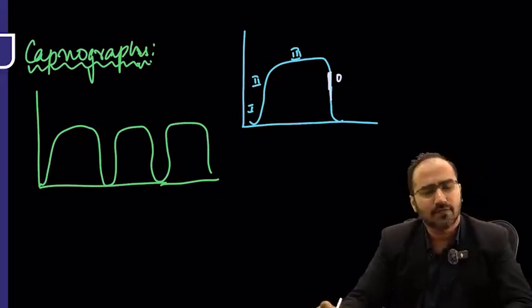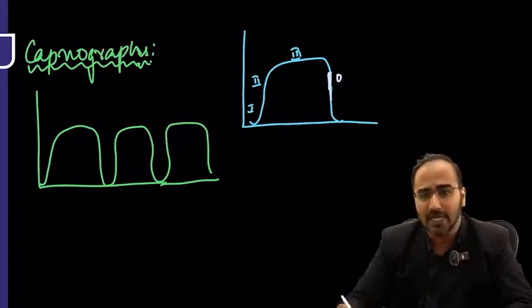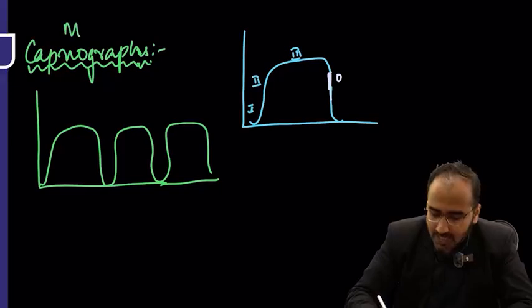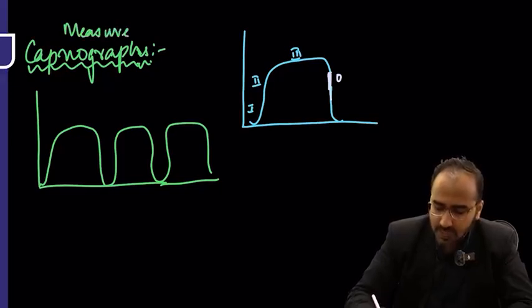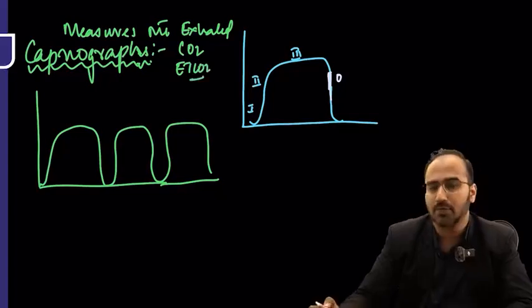Capnograph is the best test for confirming intubation. Now, guys, what does capnograph mean? Capnograph measures the exhaled carbon dioxide. Exhaled carbon dioxide, or EtCO2, is measured by capnography.